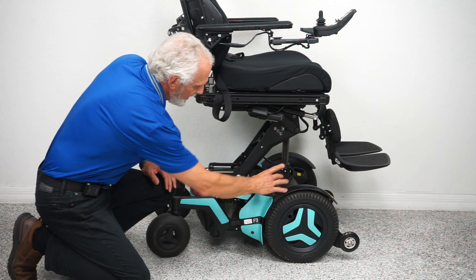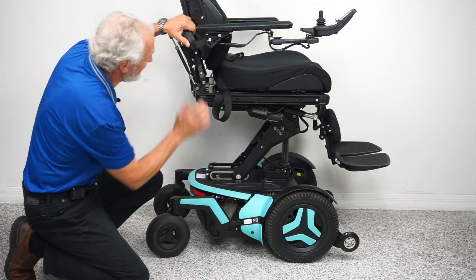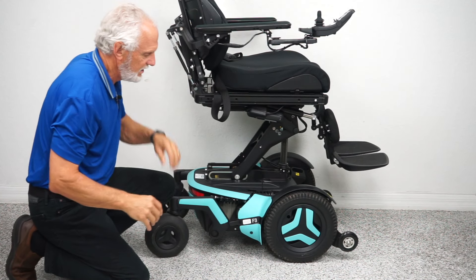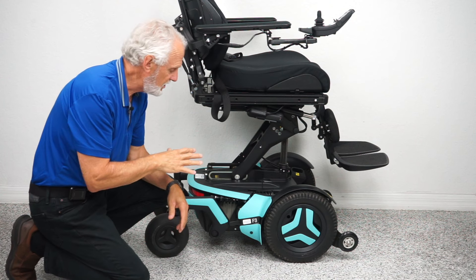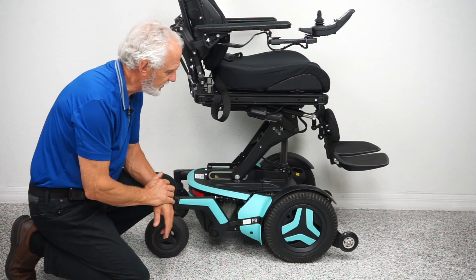The ride is going to be super smooth because you have a shock here and one here. If I push down, you'll see this shock right here on the fork. Because of the weight of the chair and with four of these — two on each side — the ride is going to be so smooth.